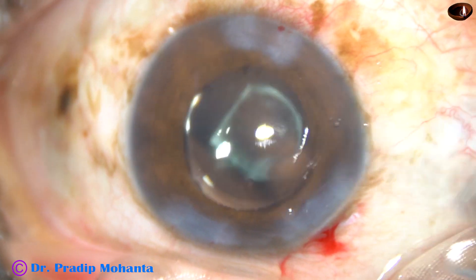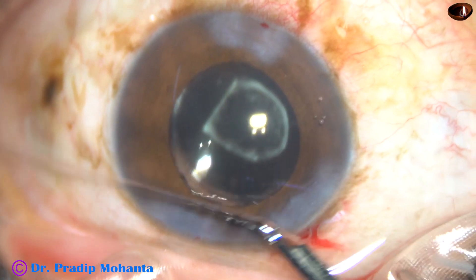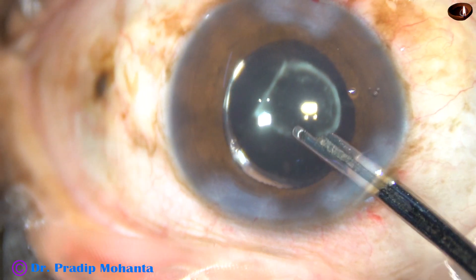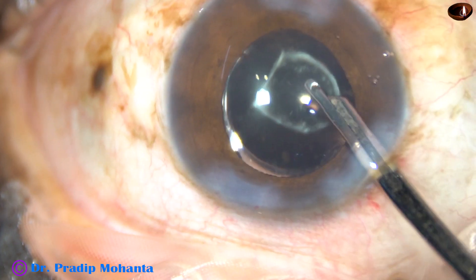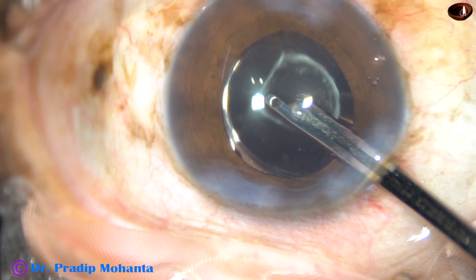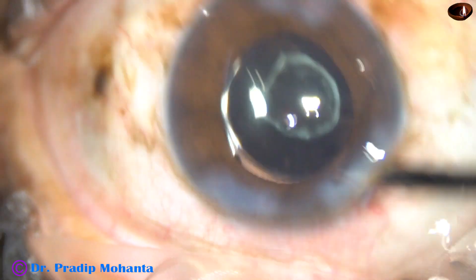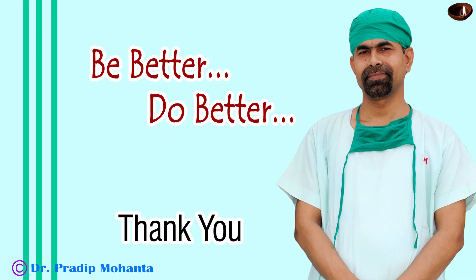Now I hydrate the stroma on either side of the stab incisions. And now this is the final lavage of the anterior chamber. Residual viscoelastic sticking to the cornea is removed, and the anterior chamber is formed very nicely. The case is concluded. Thank you very much for watching. I hope this video will help you in developing your surgical skills. This is a totally unedited surgery.